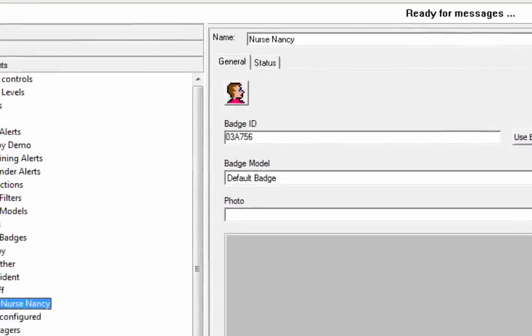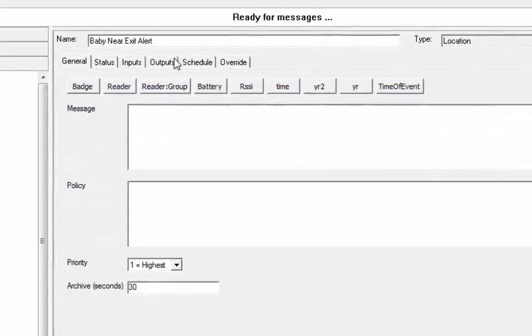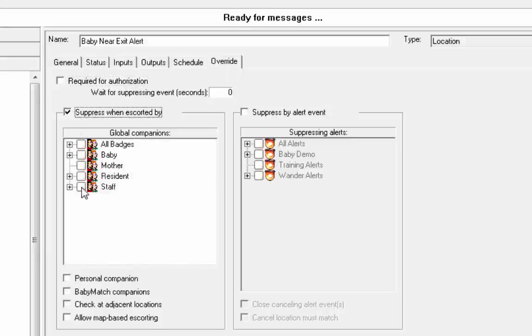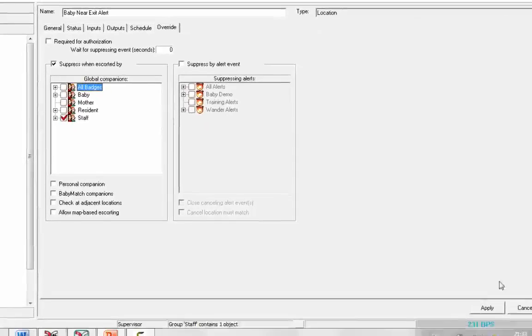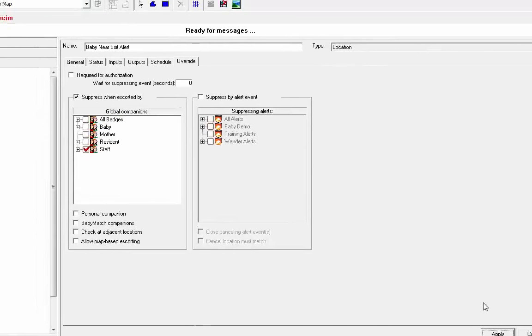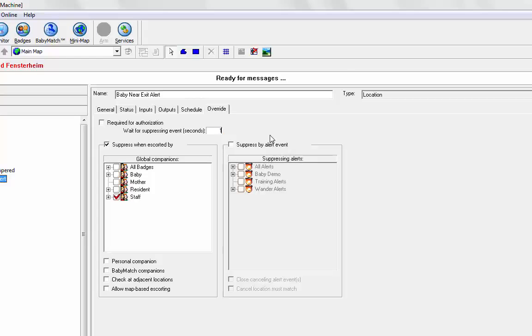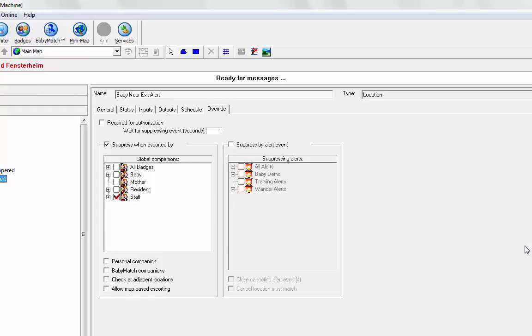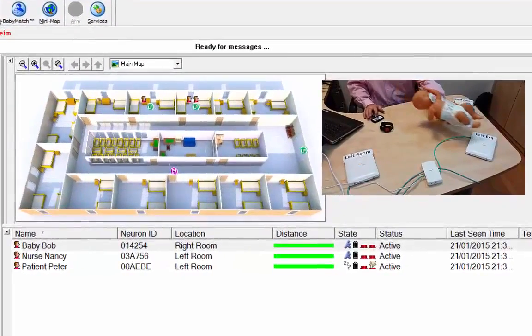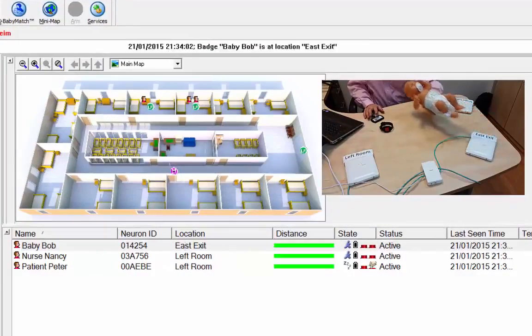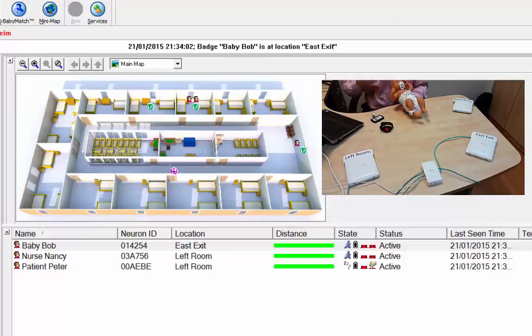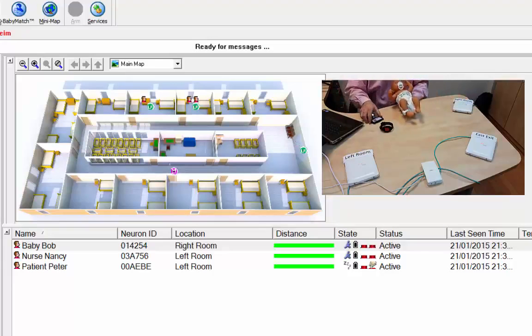Then, we're going to go into our alerts, and we're going to go to the baby near exit alerts. Where it says override, we're going to suppress when escorted by staff, a staff member. And we're going to give the alert, let's say, a second to make sure that the baby hits the LF field first. Then, it gives a chance, a one second chance for the staff to make, we can increase that time if necessary. I think one second should be enough. We're going to move it into the exit just to make sure that the alarm is still working. So, it was slightly slower because we did have that one second delay this time. Move it into the right room.